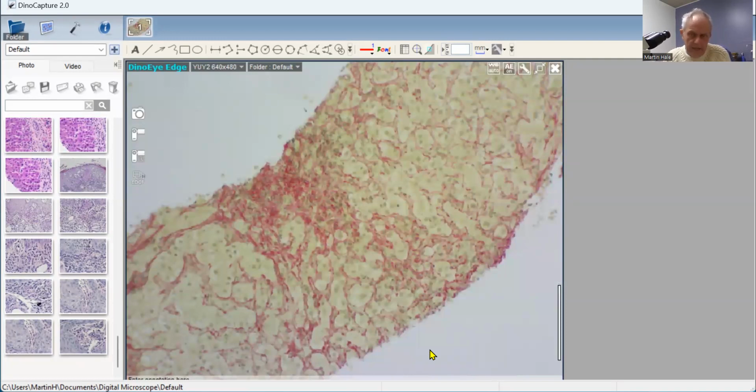We don't have any Mallory-Denk bodies, but I think the chicken wire fibrosis is a lasting telltale sign that this could be secondary to ethanol. I think the other thing that's also interesting about this is that, as Bilal mentioned, he also had a history of hepatitis A infection back, I think, in about 2000, about 20 years ago.